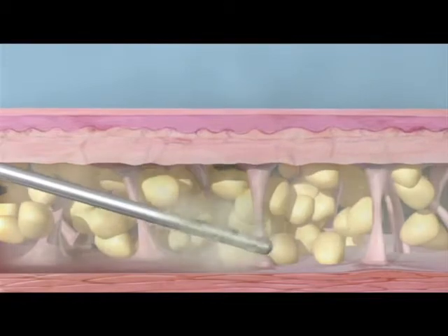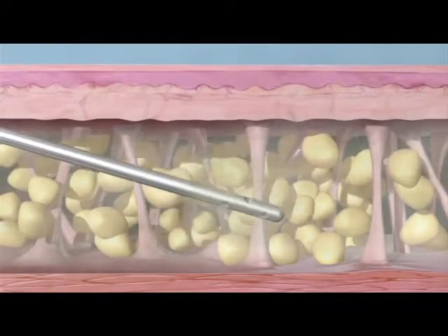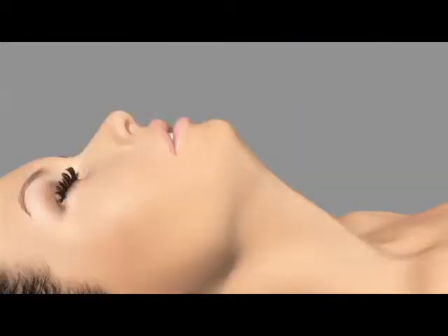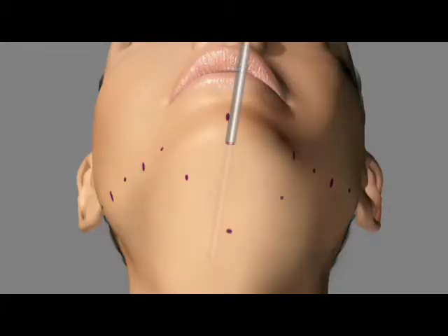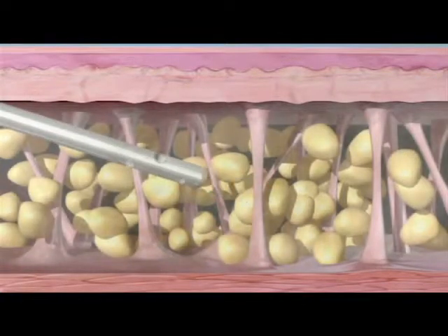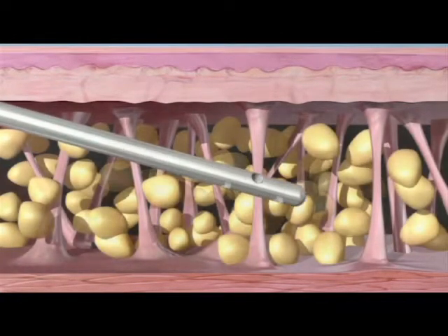Prior to doing the liposuction, the entire neck and facial areas are tunneled with a 3 mm spatulated cannula without any suction applied. This will elongate the ligamentous attachments as well as roughen the surfaces, therefore creating a scar interface which will aid in healing as well as the longevity of the results.